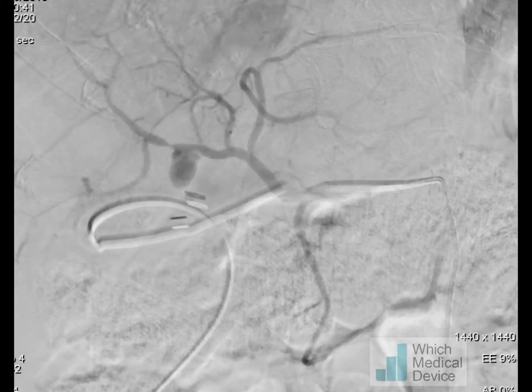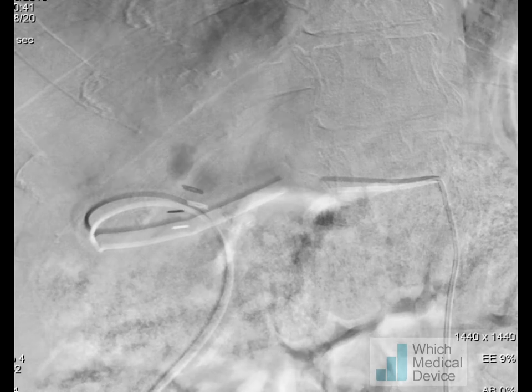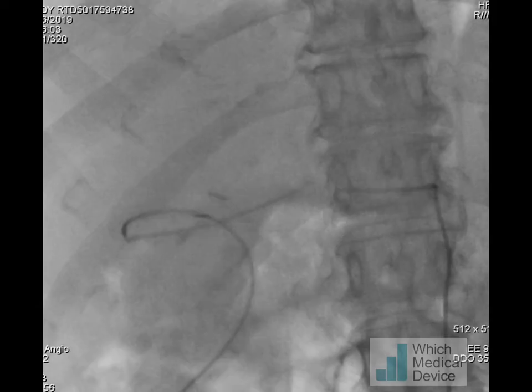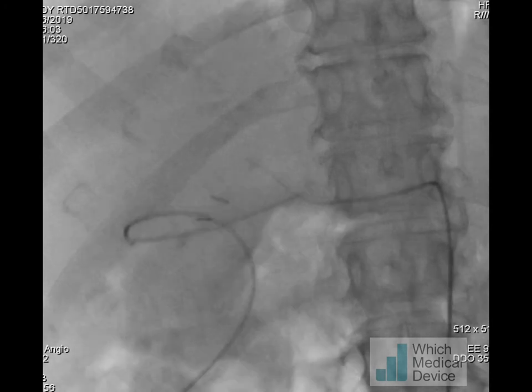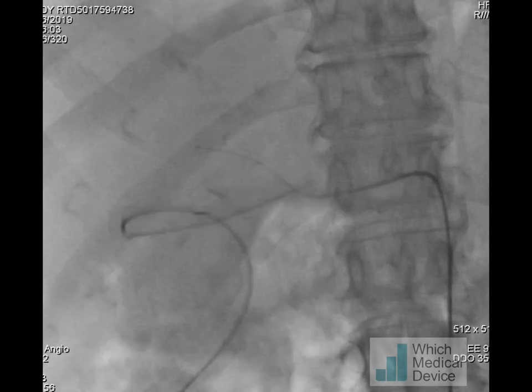Angiography was performed via a femoral approach with a 5 French sidewinder or SIM2 catheter, and you can see clearly the pseudoaneurysm from the right hepatic artery. We had to exclude this from the circulation and it was decided to place a covered stent across this.